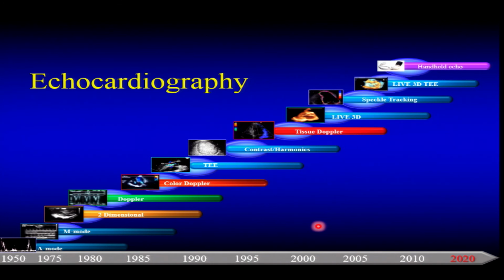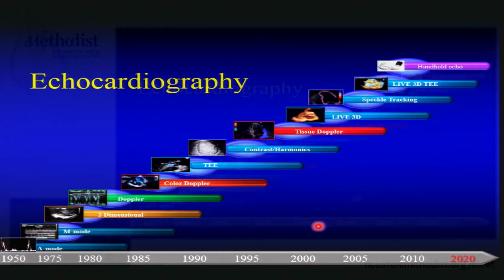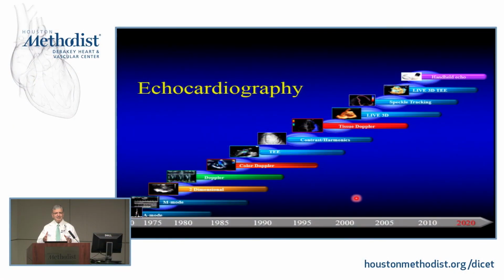Exciting special material that emits ultrasound that is sent to the body or whatever organ, reflected, and you ask mostly 2 questions. 1, how far, how intense? And 2, did the ultrasound shift one way or another to tell me about velocity and so many other things.